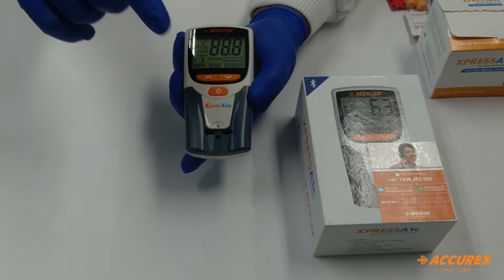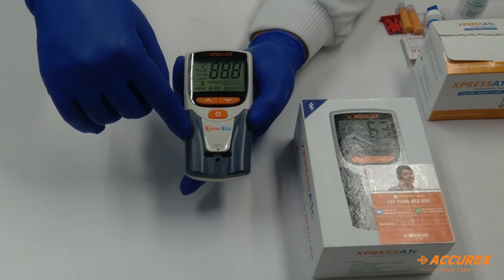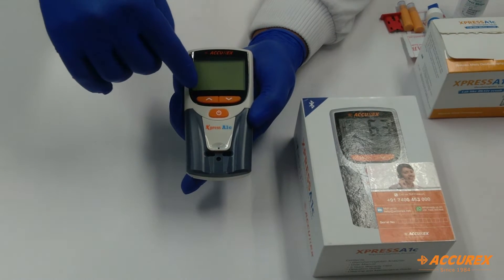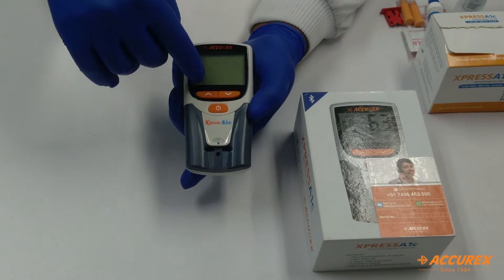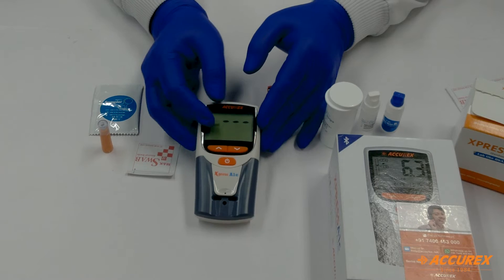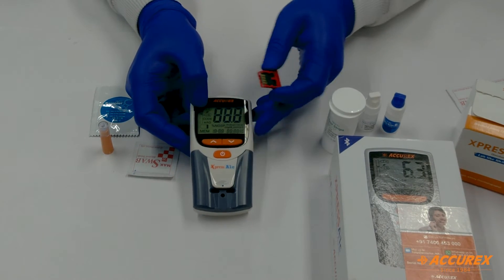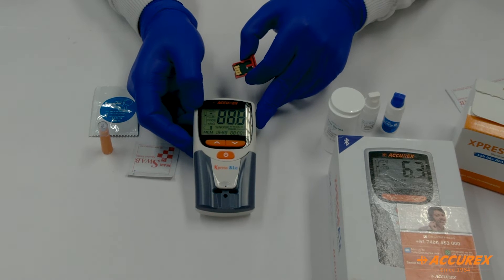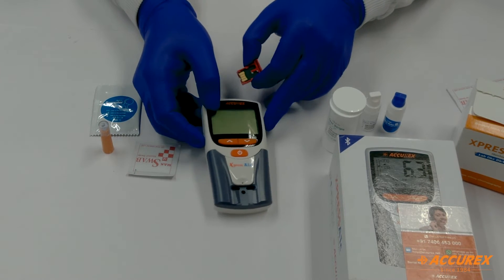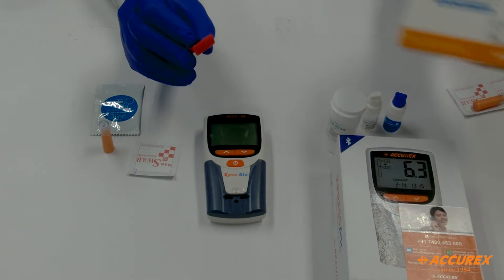Then just turn on the machine and proceed. Now it is asking for the calibration code chip. We will see the next step. Now we will start the testing procedure. Turn on the machine — welcome to the A1C easy test system. Once the machine is turned on, please insert the correct calibration code chip. The code chip is given inside every box of the test strip.